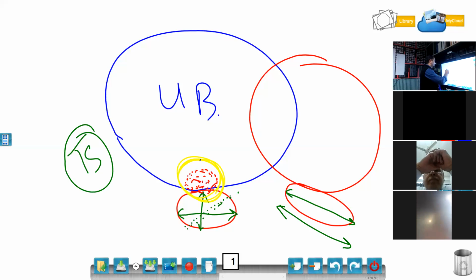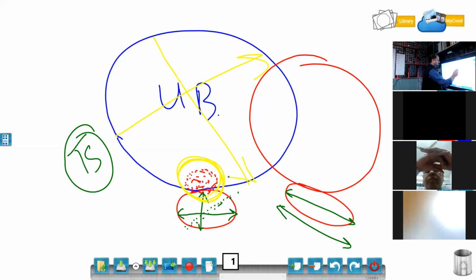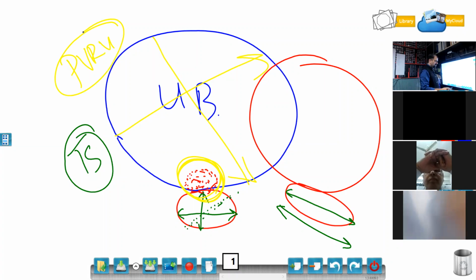And you have to measure the full volume of the bladder, and you have to measure the post-void residual urine also. And one more important point, that there can be a small cystic structure in the prostate which is absolutely normal if it is very small with clear echoes.